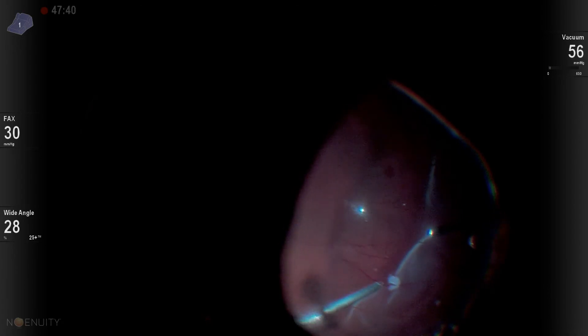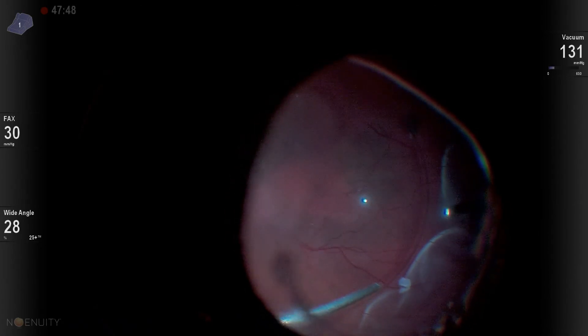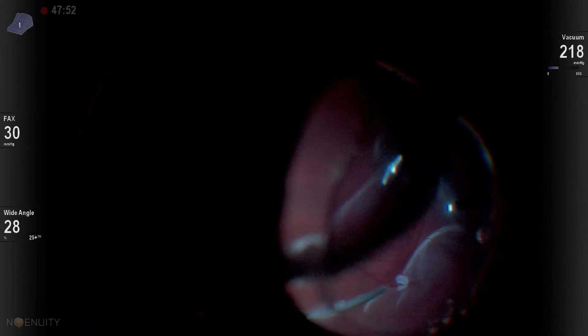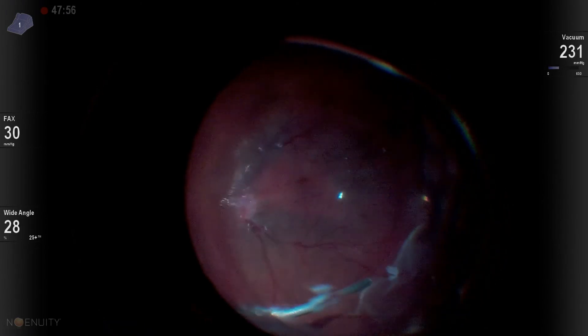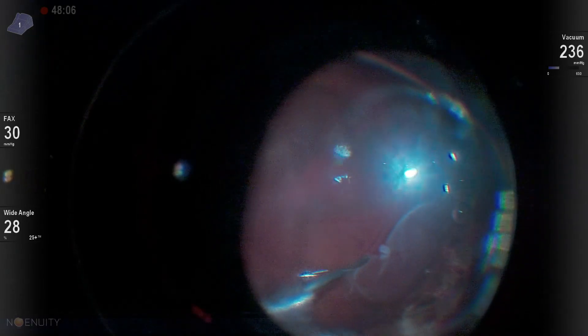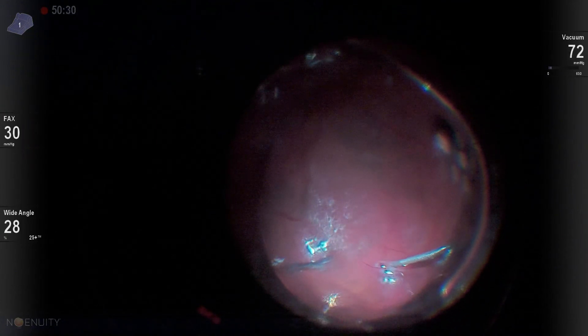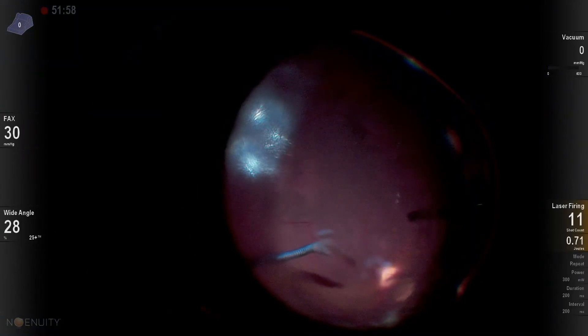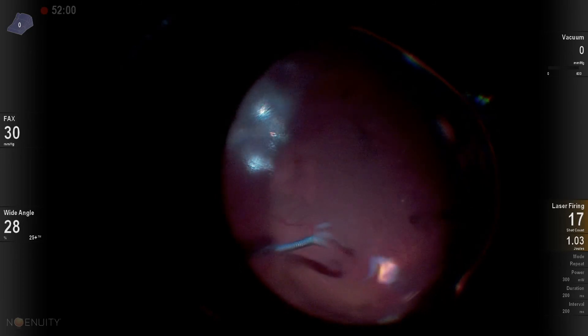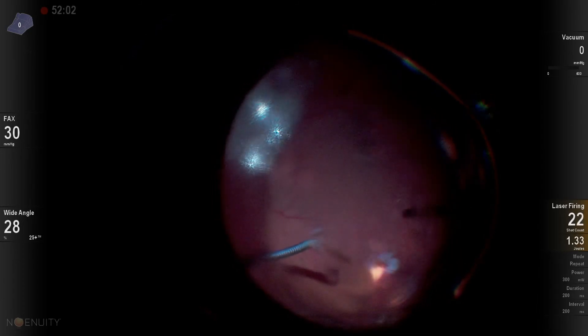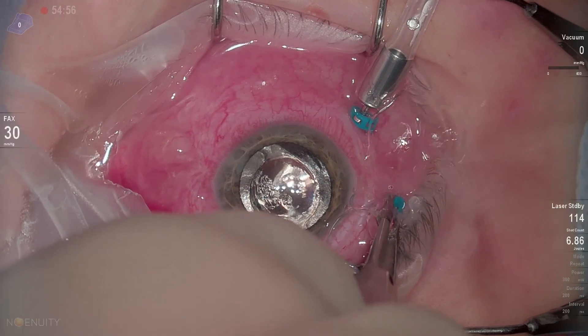I create a draining retinotomy because the patient was attached before I injected this subretinal fluid. And I'm going to drain through this draining retinotomy and be sure to drain this patient absolutely meticulously flat because we don't want to see this come back. Laser that area, and I'm happy to say that the patient has done really well. Vision has improved from 20/400 with the macular fold to now at last visit about 20/40. Thank you so much for watching.